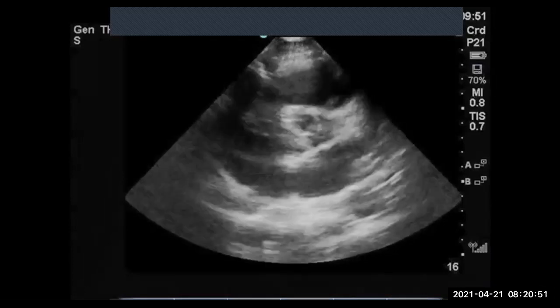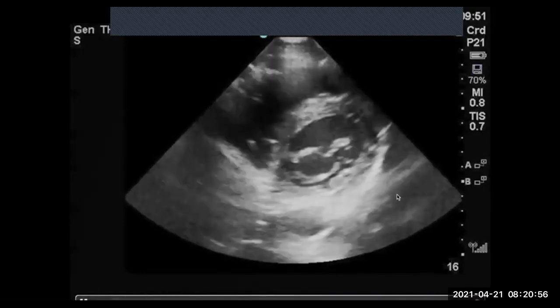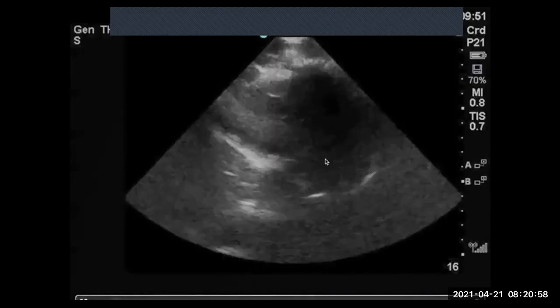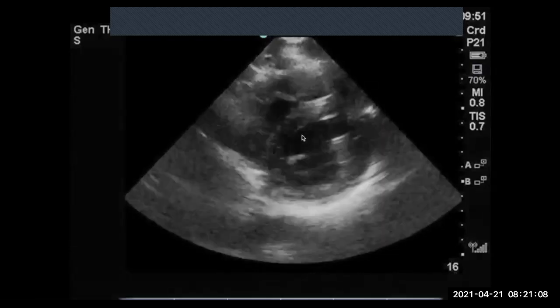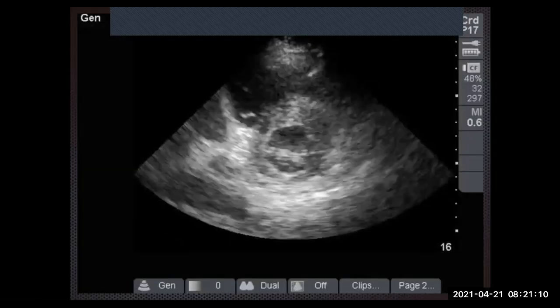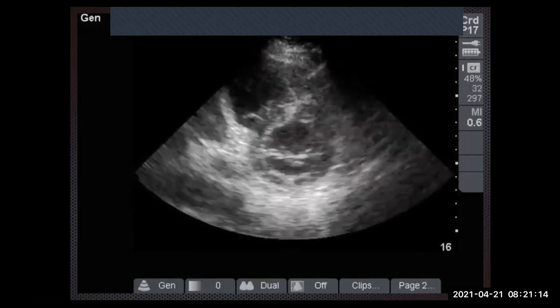Okay, so here we have the bileaflet mitral valve over here. And then as you start to scroll back up, you're going to start seeing what we call the Mercedes sign, or the tri-leaflet aortic valve. So let's go through some of the structures a little bit more closely.